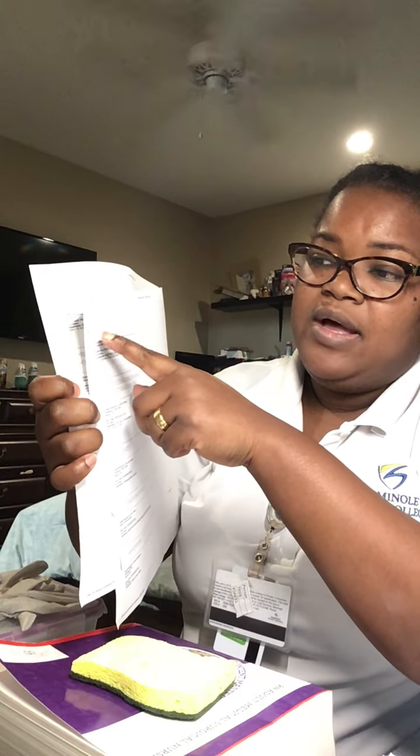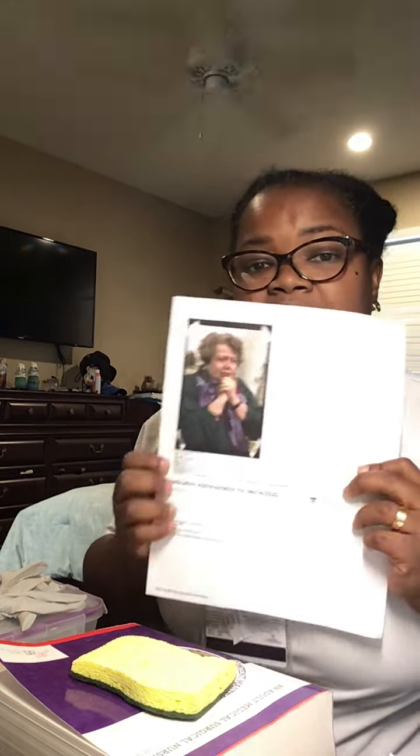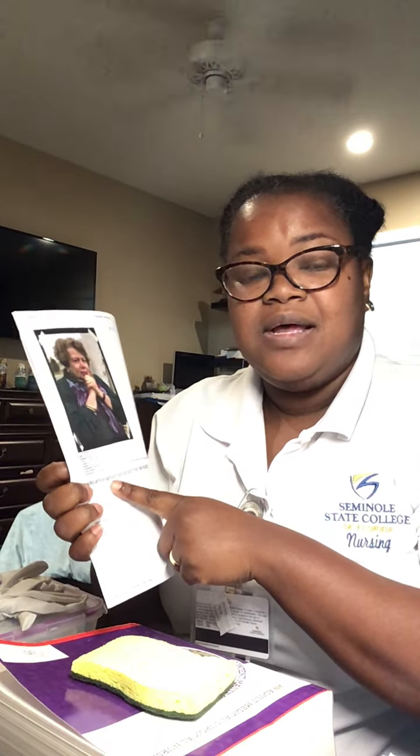I find that for subcutaneous I have B12, and for the intramuscular I have the influenza vaccine. This is my patient, Anna Pawlowski. She has an allergy to penicillin and the reaction is hives.